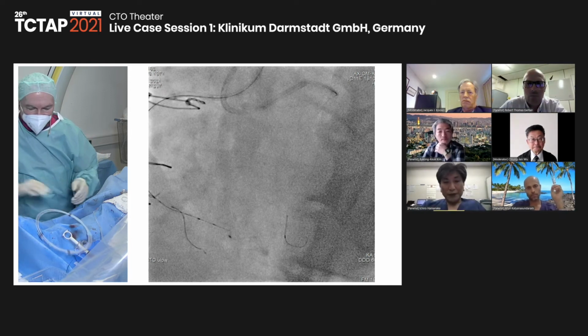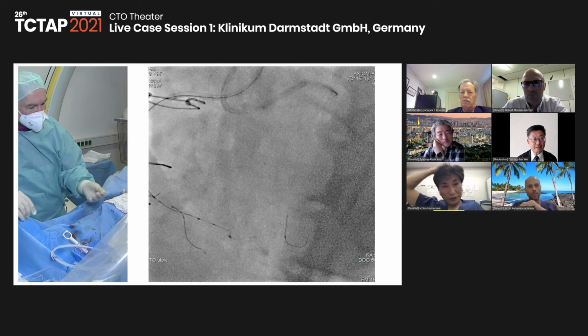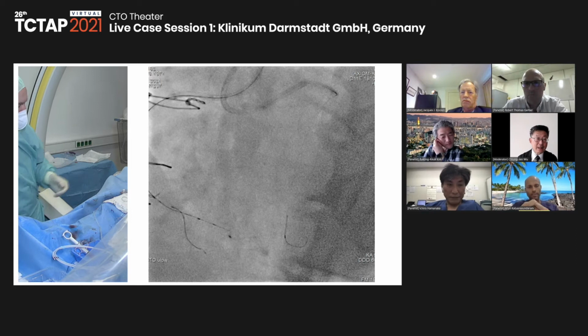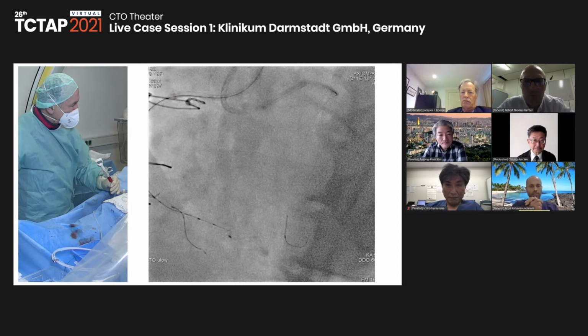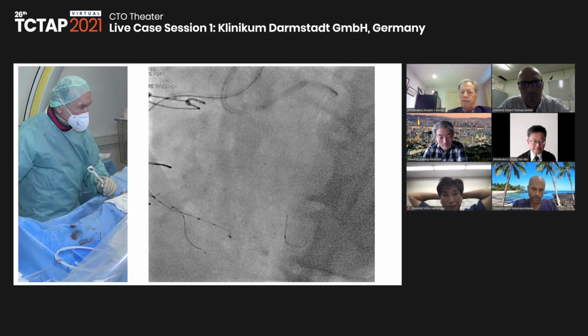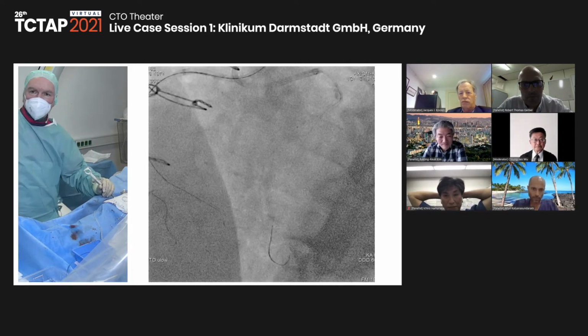Could you do a tip injection from this microcatheter to see the Caravel? Yeah, we can do that. I can try if I have a flow back. You should, you're in the vessel. That should really delineate the distal cap pretty well. I hope everybody realizes how interesting and helpful biplane is, especially for the right coronary.